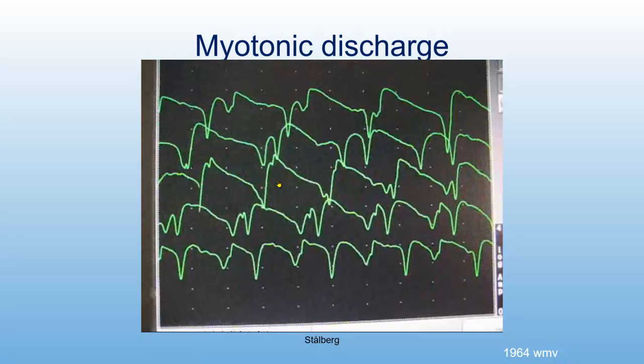It is very difficult or impossible to measure the parameters of the motor unit potential in this situation. It's so disturbing with all the spontaneous activity. And one trick is to activate the muscle for a minute before the study. By activation, we can fatigue the muscle fibers in some of the myotonic conditions at least. That is corresponding to the warm-up effect. And then we can make voluntary motor unit potential analysis.